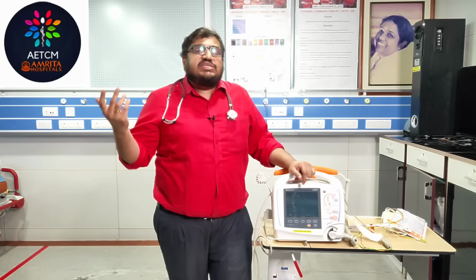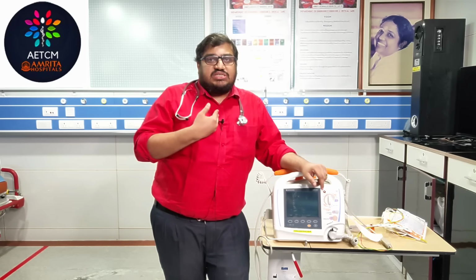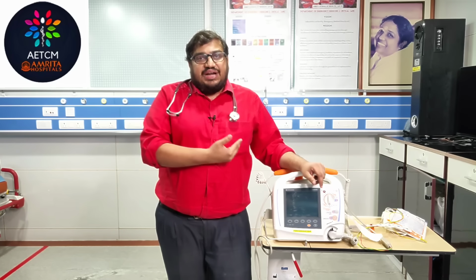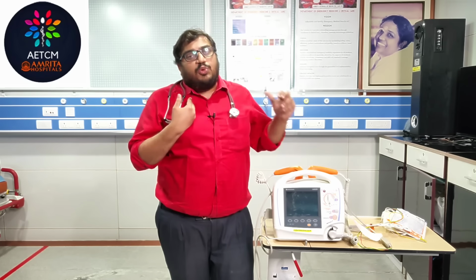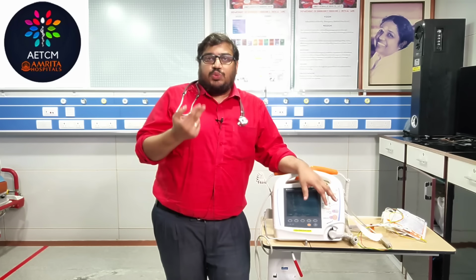Where to keep the paddles, I said one over the right side of the chest, just lateral to the right border of your sternum, and one over your apex, that is your anterolateral. Then you have your anteroposterior. The right side is the same, and posteriorly just below the tip of the left scapula. Those are the two positions.